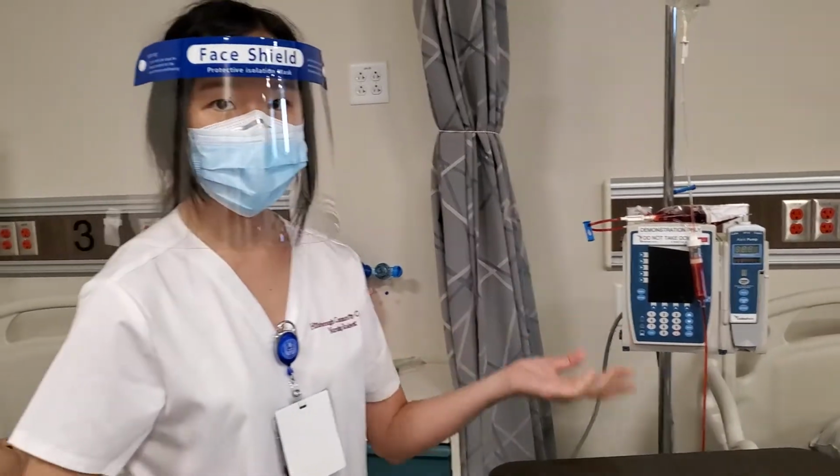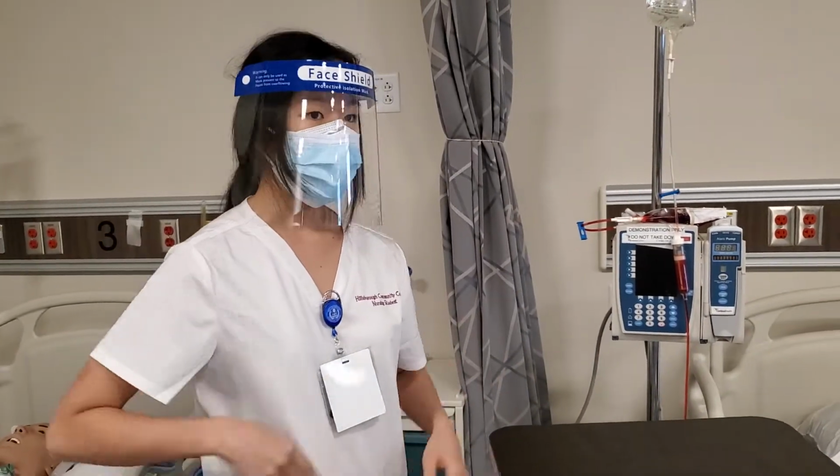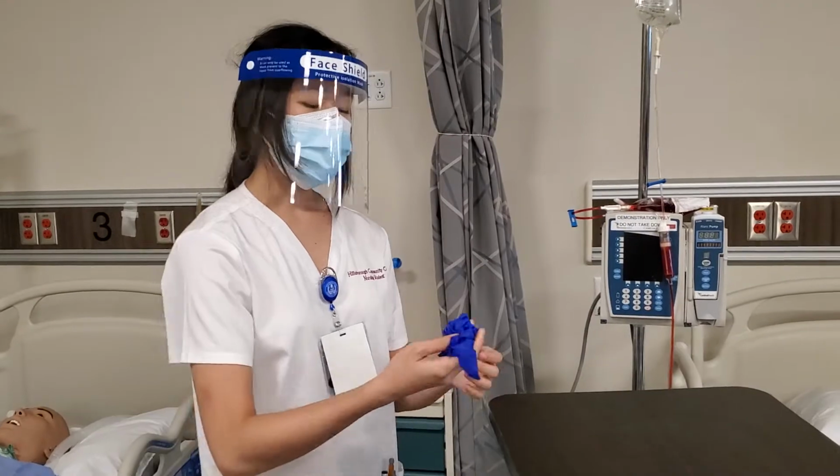And then once I enter the room, again I need to perform hand hygiene and don gloves.